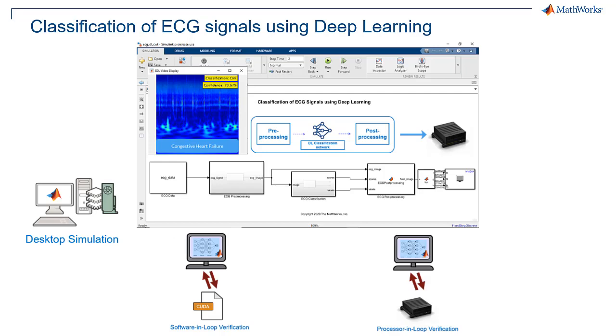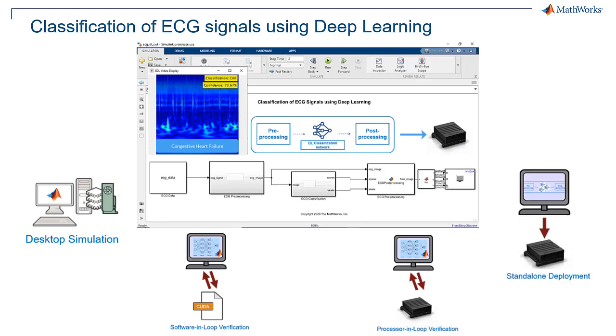Finally, we take our complete application, generate CUDA code, and run it on the Jetson AGX Xavier.